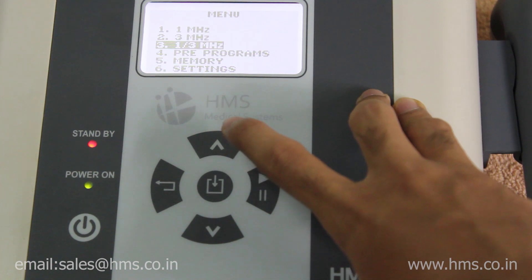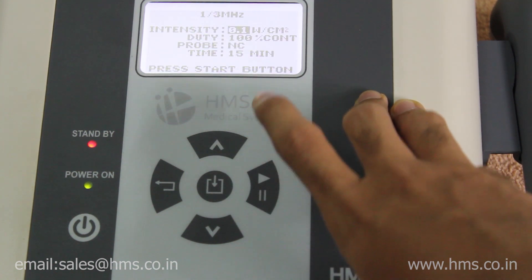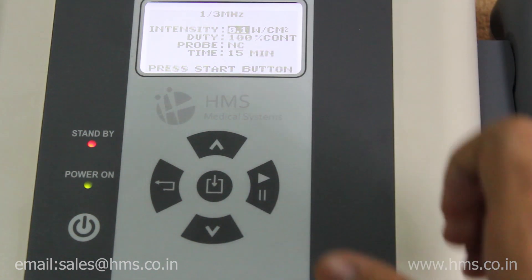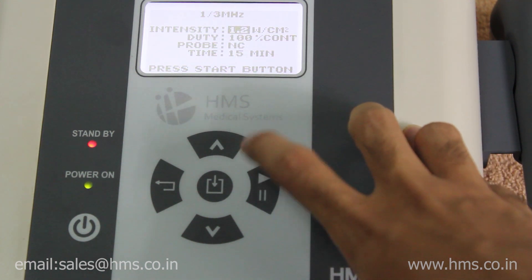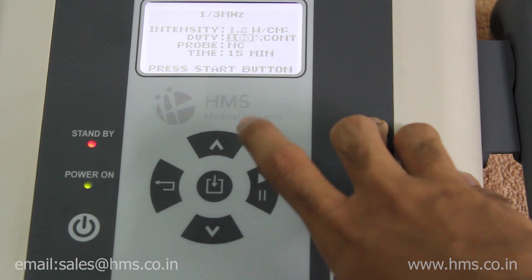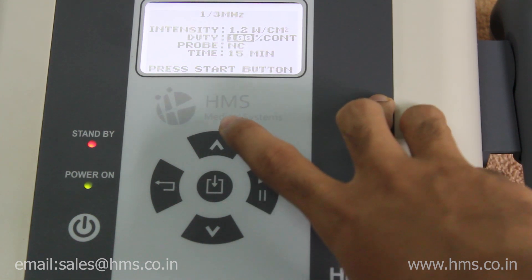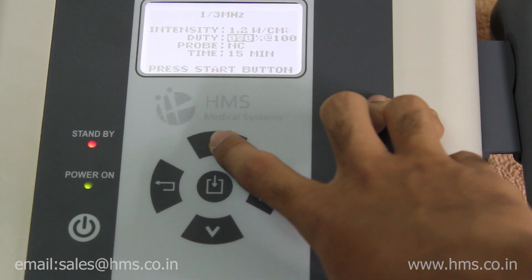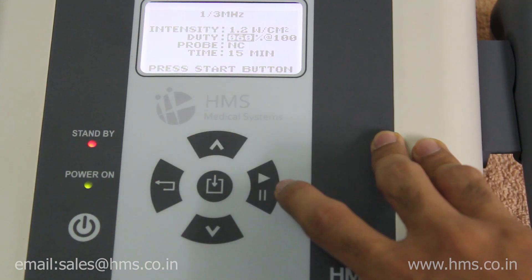In the 1+3 MHz frequency mode, the middle button is used to select it. You can set the intensity level using the up button before starting the treatment. Next, you set the duty cycle, which can be set from 10% to a maximum of 100%, giving a total of 10 duty cycle options.